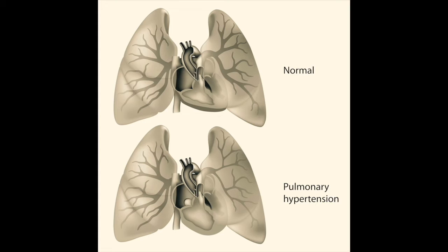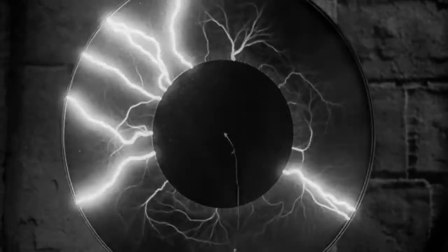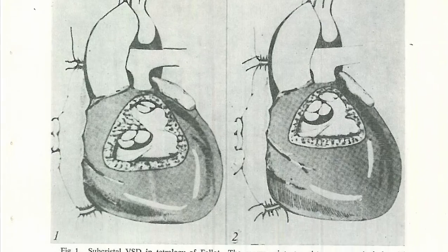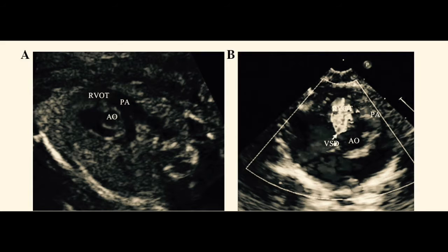Now, my last resort, VSD. A hole located between the two ventricles could work. Performing an echo, I could see my creature did indeed have a membranous VSD and not a muscular, nor inlet, nor outlet VSD, the rarest form of all. Along with my sonographic findings and the presence of a heart murmur, I knew for sure my monster had VSD, thus could be saved until the surgery could be performed.